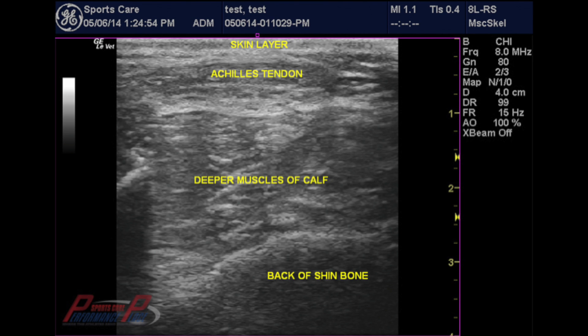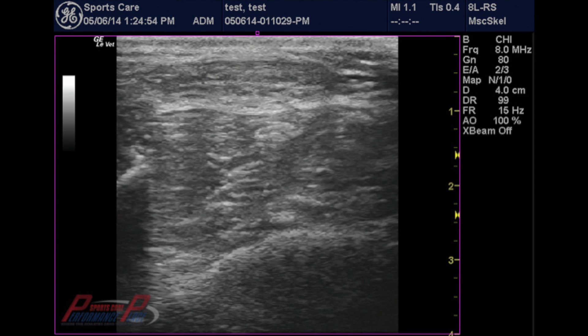This next one is what we call a short-axis field, or cross-sectional view. Skin is at the top, then we have the Achilles — which in this case we labeled — and you can see that it's a cylinder-like structure. Just deep to it is some deep calf muscles, and then you have the back of the shin bone, the tibia. Going through an unlabeled picture, I think you can see what the normal structures are, and everything looks like it flows very well. There's not any blatant differences within this picture that someone with less experience could pick out.